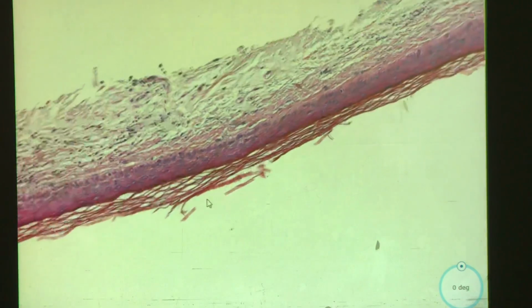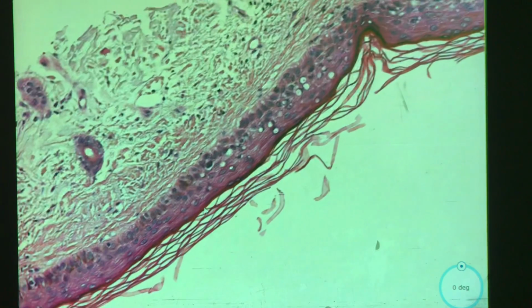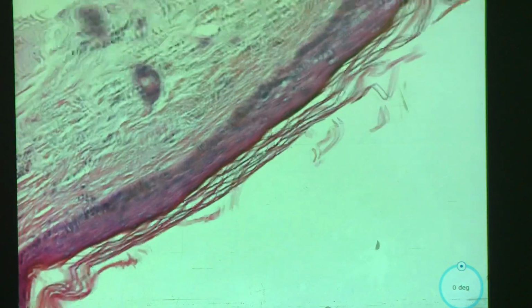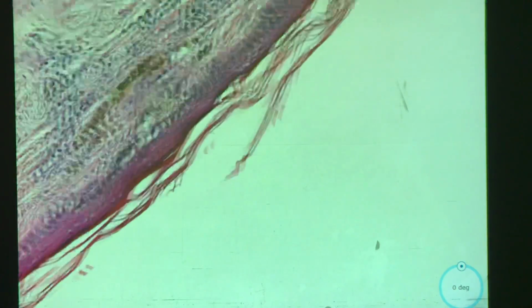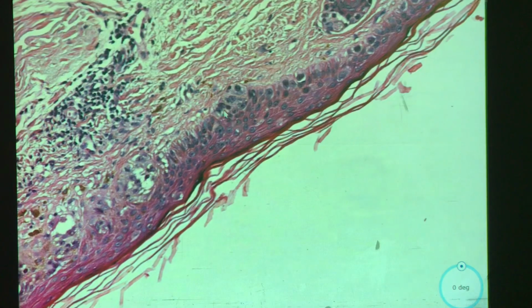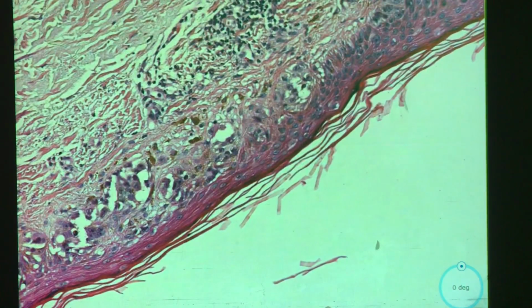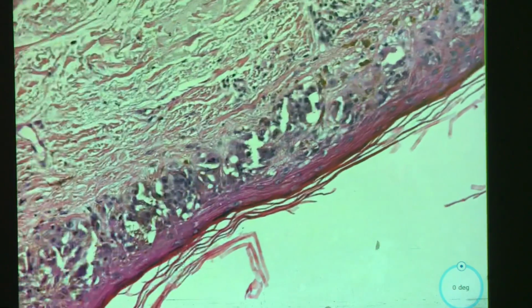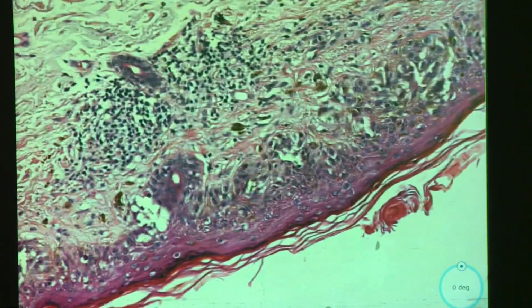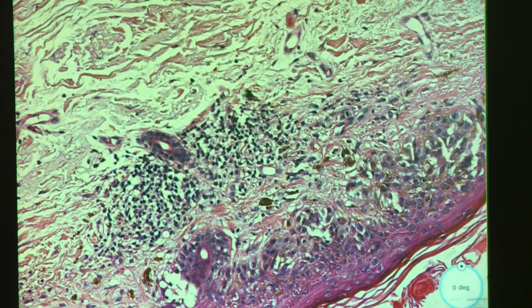Okay. Well, again, just looking at this, it definitely looks a little weird. There's these sort of cells that look like melanocytes that are just kind of atypical. So if I don't see anything else as I'm going through this, I'm going to definitely call this at least in situ. But it looks like it's coming, maybe here. Oh, okay, look at that. It's kind of invading into deeper. I think it's going into the dermis here.